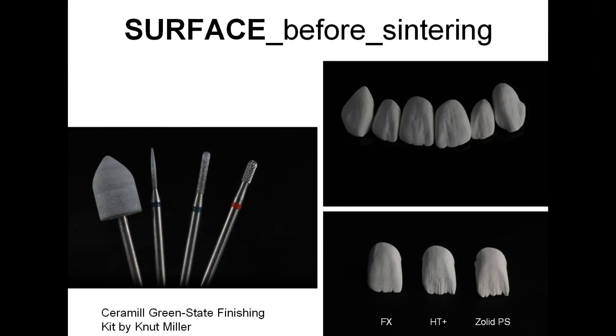It's preferable to overstate with mamelons. After all, if you don't like it you can always smooth it out after sintering. Tool number four is used to remove excess on connectors. And later in the final stage, we smooth the surface with tool number one. You can use this tool to smooth out any corrections left after milling and to smooth the position of connectors.